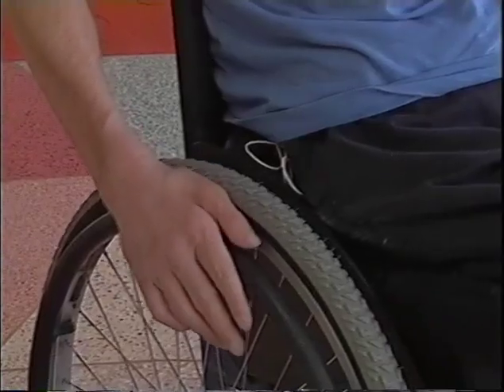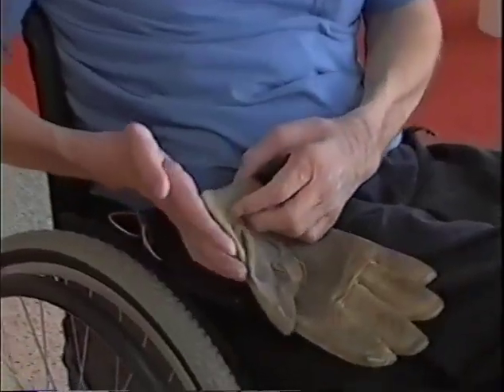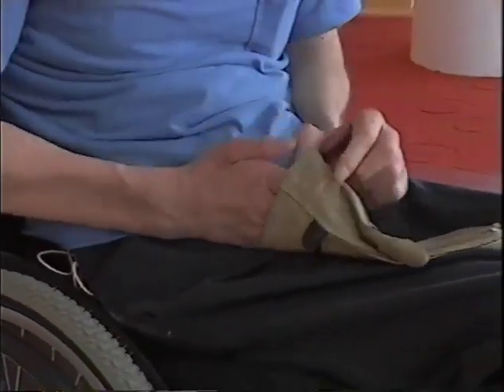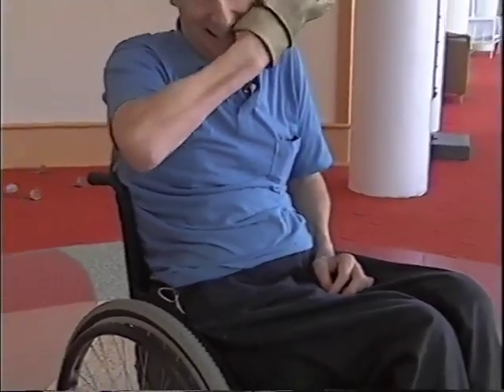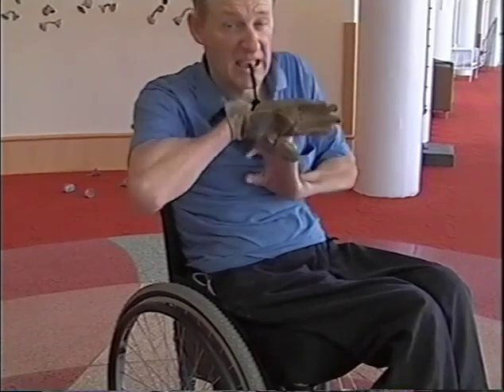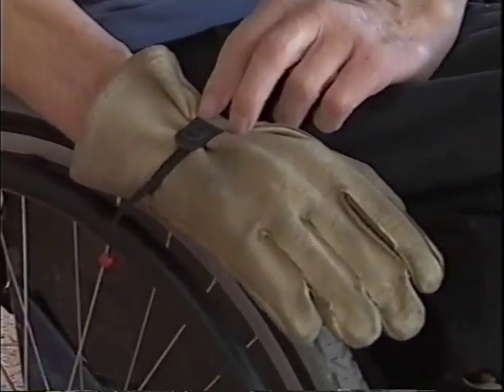The problem with trying to use hand rims is, even though they're a high friction, they're still rather slippery, and you need to develop your pectoralis muscles in your chest to be able to get enough inward force to generate that friction. Another little thing that you can do is simply wear a glove, and this is just a leather glove that I generally use. May not look too delicate, but I get a glove with a strap on it, and that keeps it on. So when you're stopping, this glove won't pull off your hand.